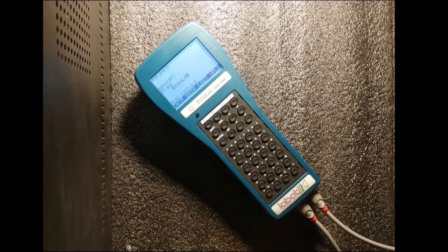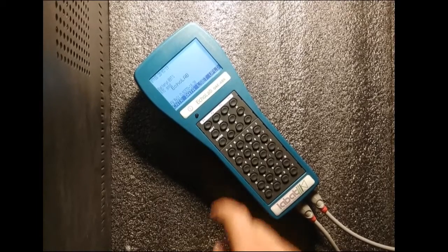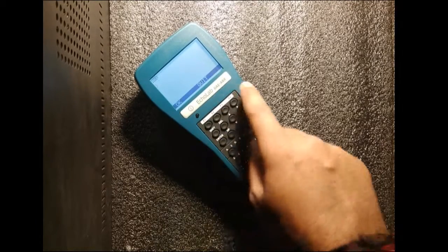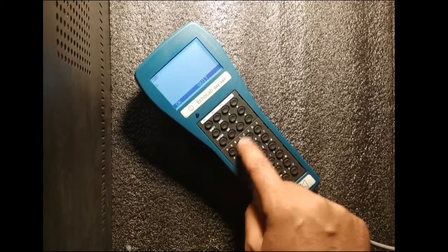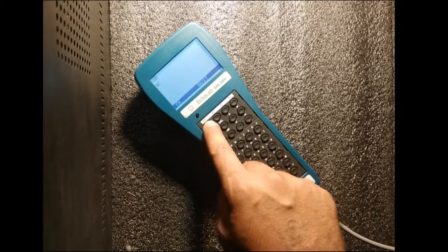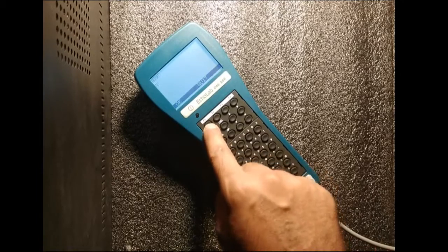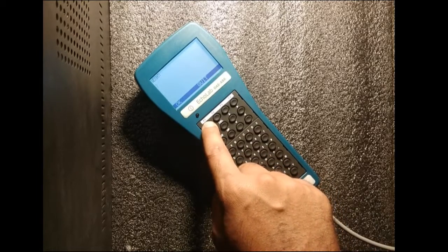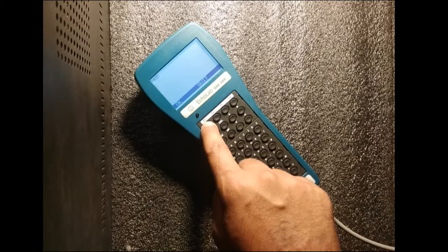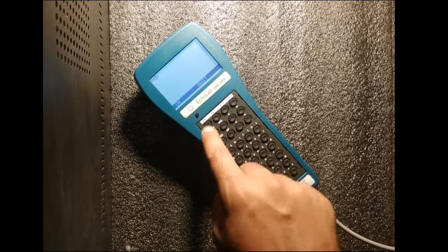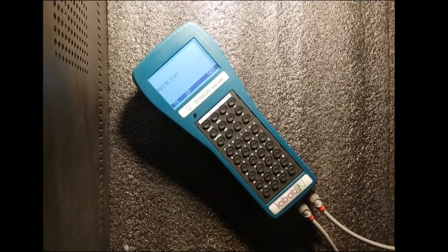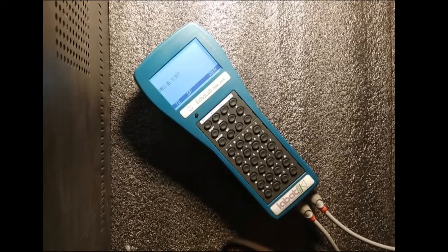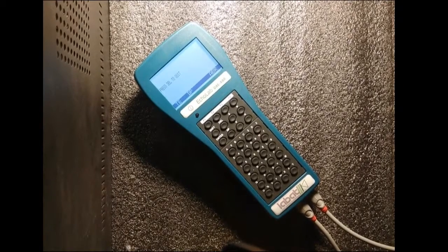Here we will be doing screening ABR, so for that we will press F2. It asks for a code, so we will enter any value we want - you can enter the patient name also. Now I am pressing F1 to lock it. I can skip it by pressing F1. Now we are in the test menu.